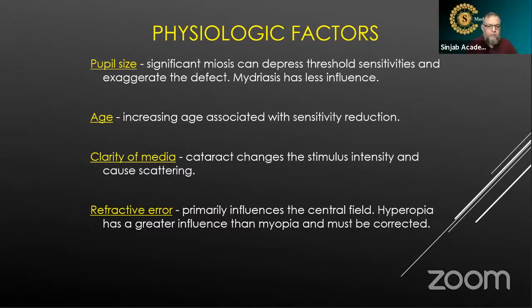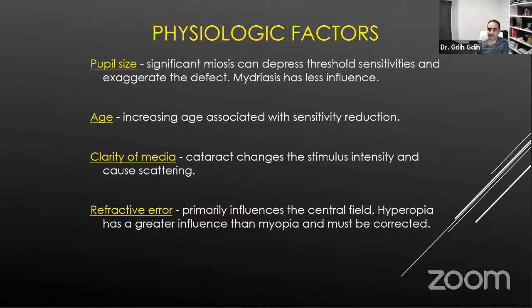And regarding the refractive error, I think there is a holder to hold a corrective lens for presbyopic people and so on. You are going to talk about that, yes, because it has a restriction of the field. You're absolutely right.